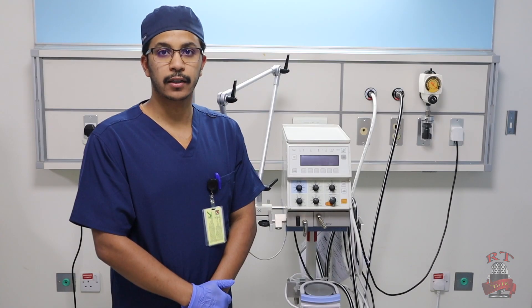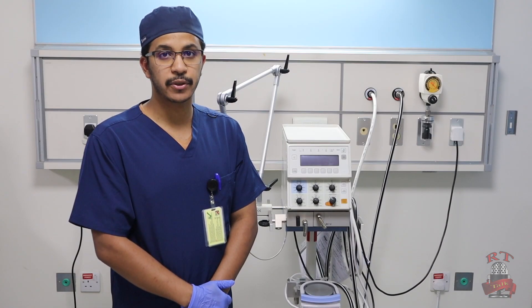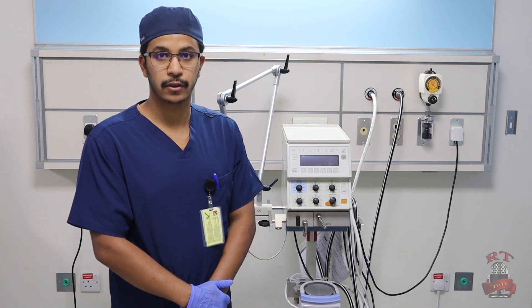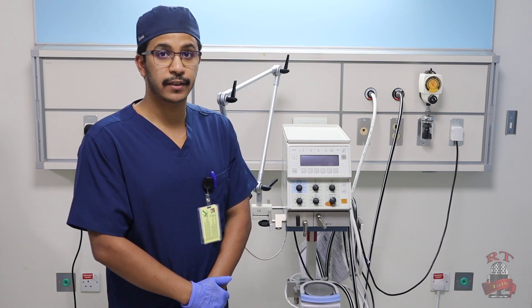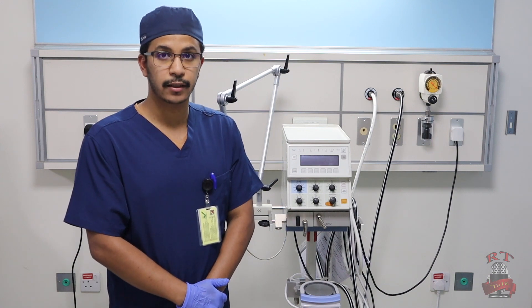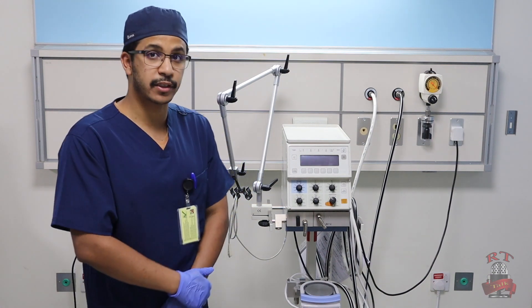As-salamu alaykum wa rahmatullahi wa barakatuh. My name is Khalid al-Bishi and I am a respiratory therapist. Today we'll show you how to set up the Babylog 8000 Plus ventilator for a neonate. We already have our machine and our ventilator circuit ready.